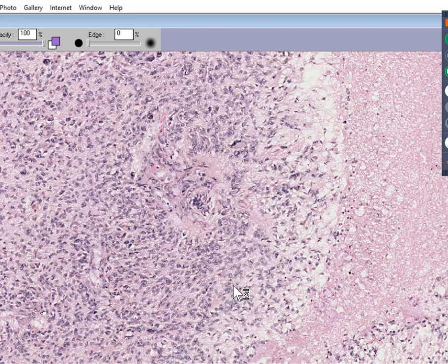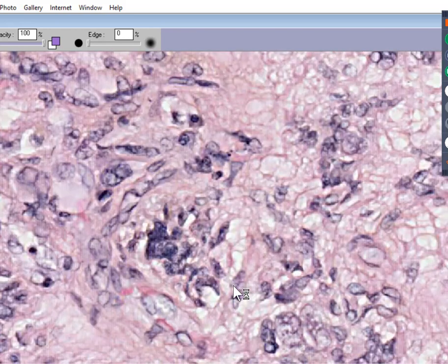So let me see if I could prove that or not. Oh, yeah, I think I might convince you that this is maybe a blood vessel. So what does that mean? It means that tumor cells, which grow very rapidly and are very malignant and have a bad prognosis, are more likely to be seen viably surrounding the blood vessels that feed the tumor. And eventually, the further you move away from the blood vessel, the more necrotic the cells become. That's why they call it the perivascular growth pattern. So let's summarize this thing. It's a brain tumor.